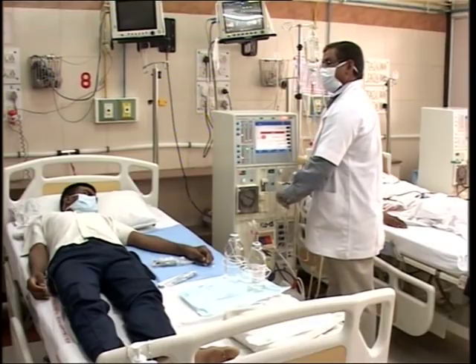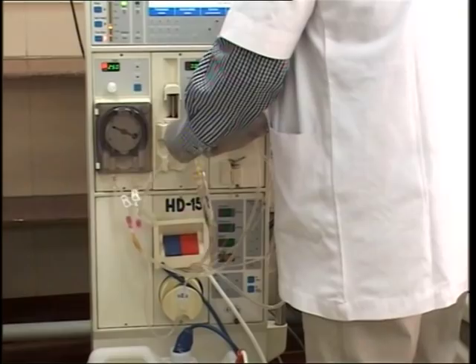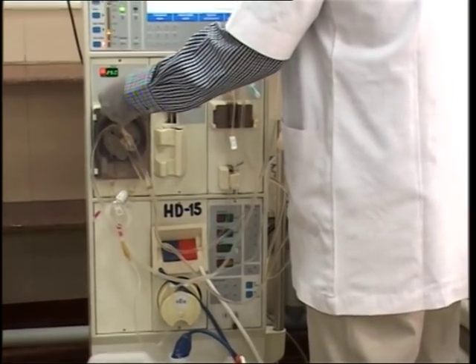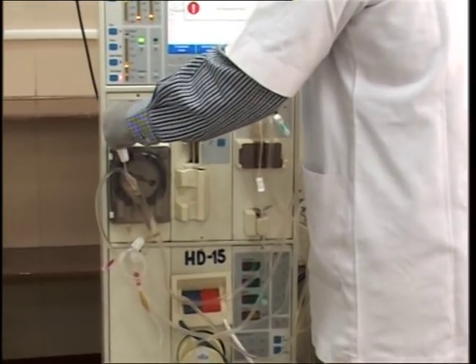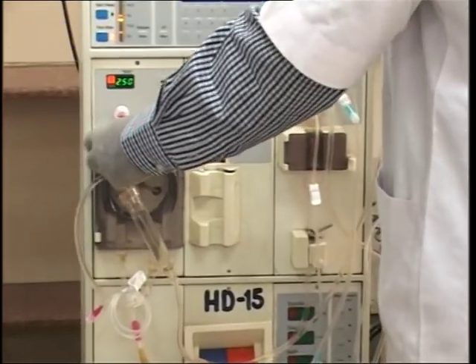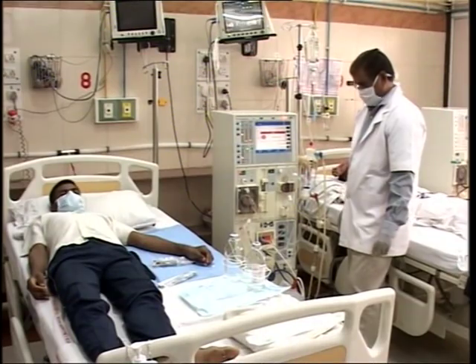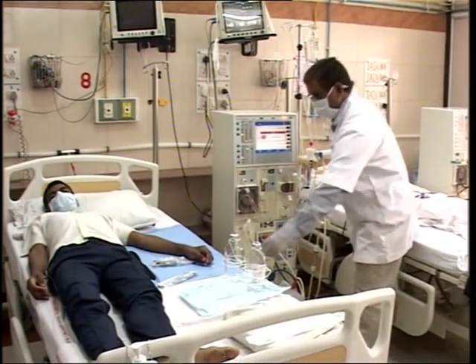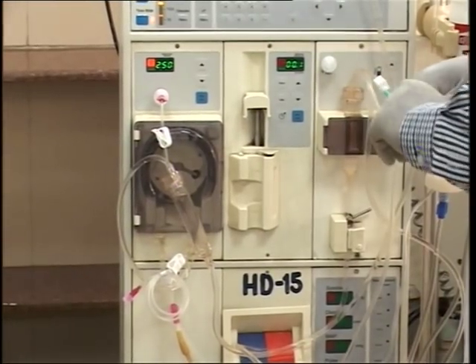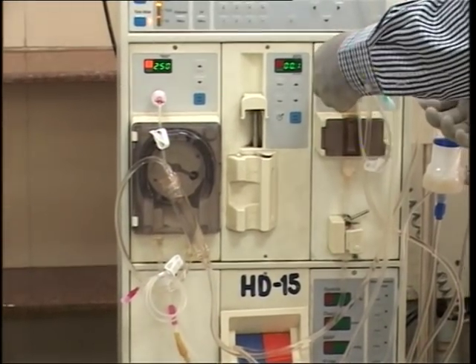The post-pump pressure monitor is attached by another transducer to the hemodialysis machine. These monitors guard against an excessive increase or decrease in the pressure in the dialysis circuit. The machine is equipped with alarms set to cut-off limits.